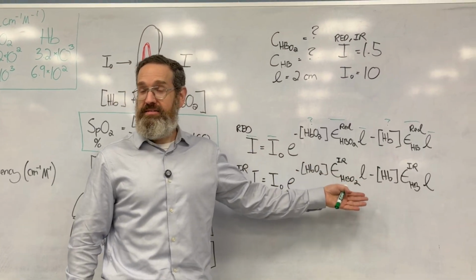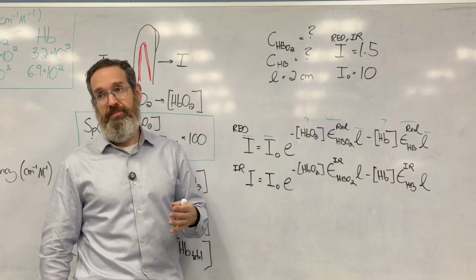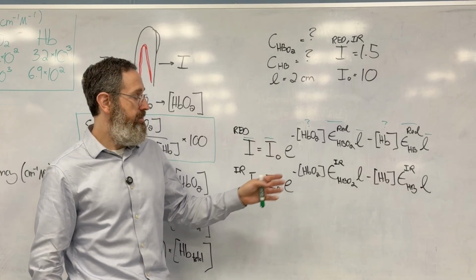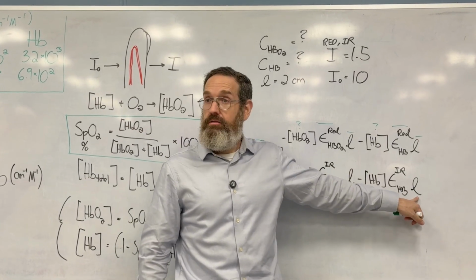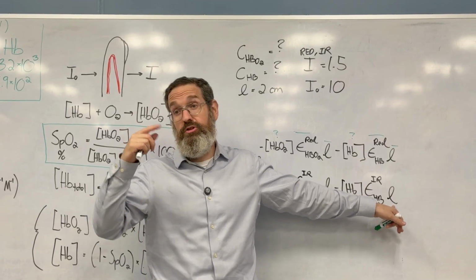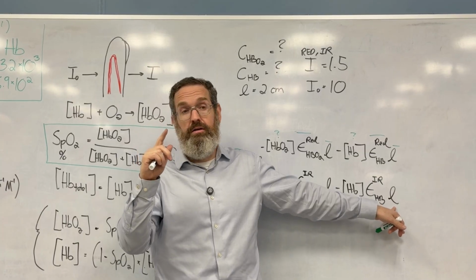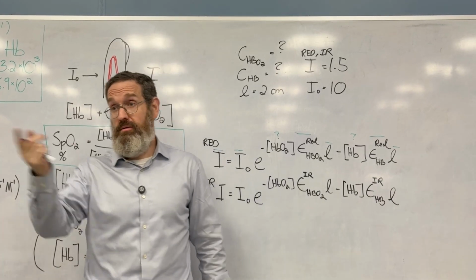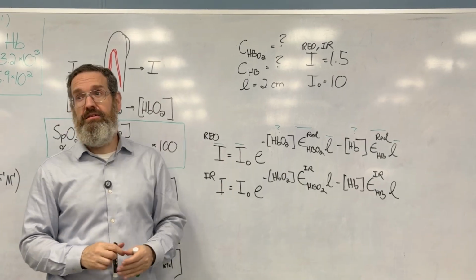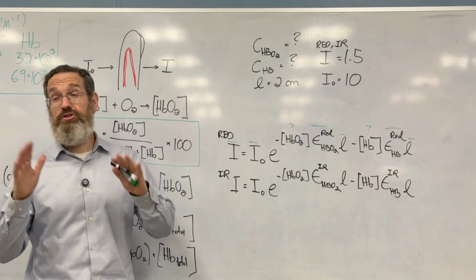So this is where we left last time. There's a little bit more to this issue of pulse oximetry. One of them is, I don't know L. Do you know the length of my finger? You could guess, but you're not sure, and it may not be Emily's length. But that's not the least of our problems. We actually have a much, much bigger problem.